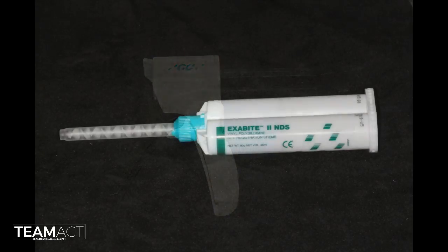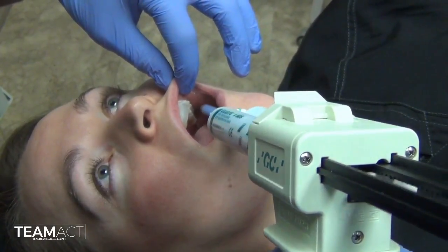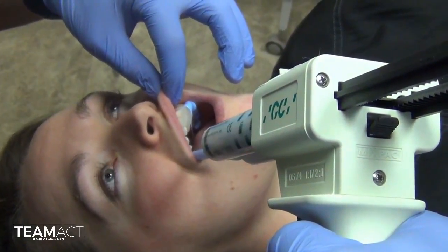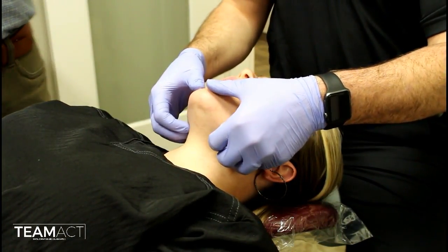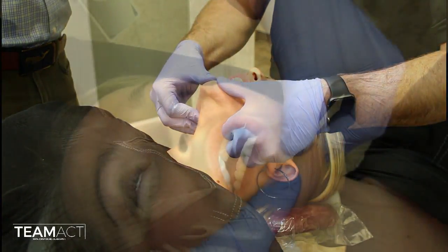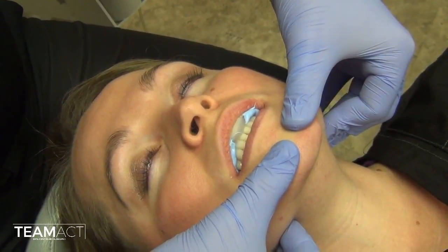Now that we have created that jig, leaving it on her teeth, I will inject GC Exabite material. You really want a rigid material with minimal distortion onto her maxillary teeth, covering the occlusal surfaces to a thickness that allows recording of both the maxillary and mandibular teeth. Again placing my thumbs on the chin and my fingers on the inferior border of her mandible, guiding her as she closes into that jig, and I will retain that position until the material sets up.